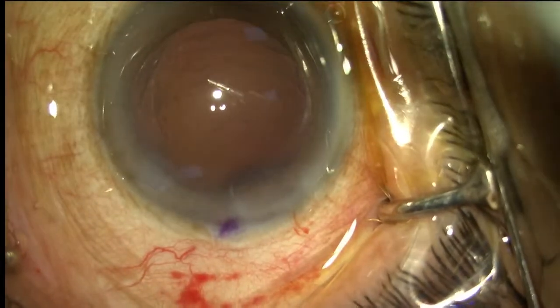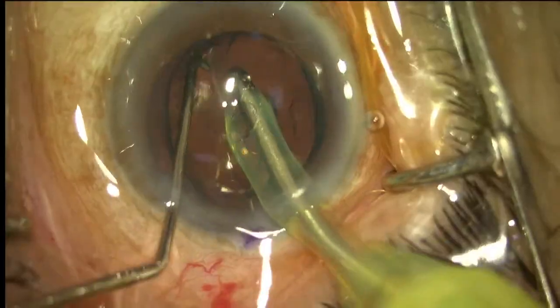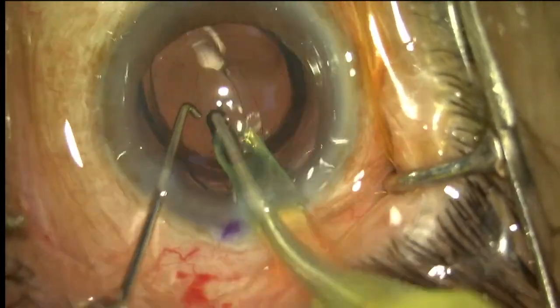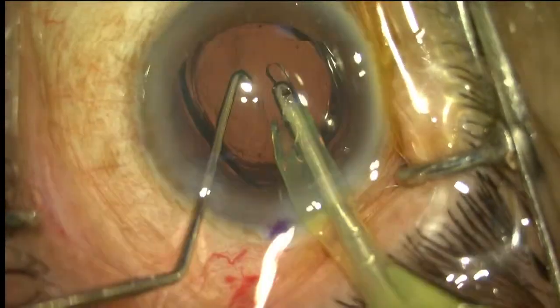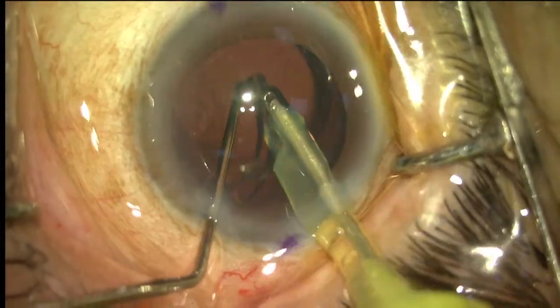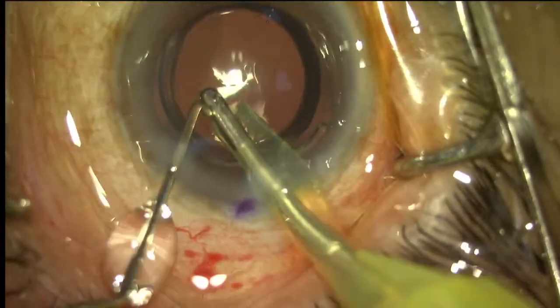So this patient has 1.62 astigmatism at 2 degrees. So here this is injected.